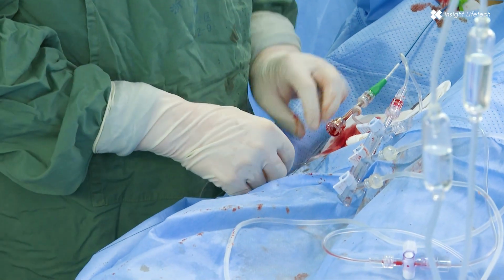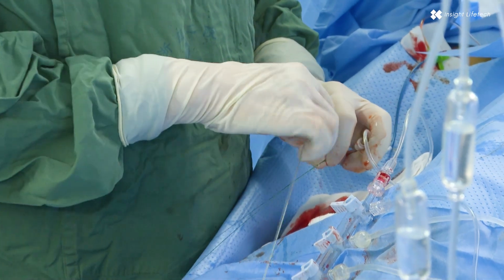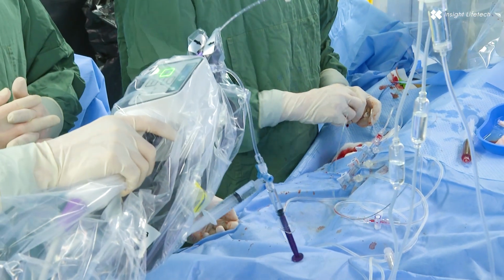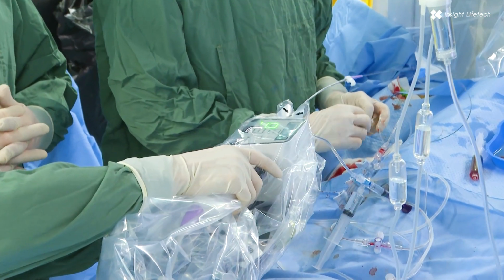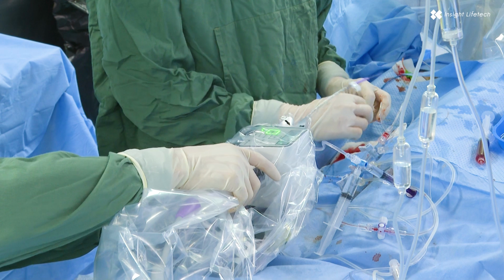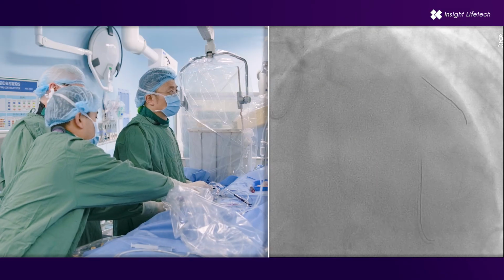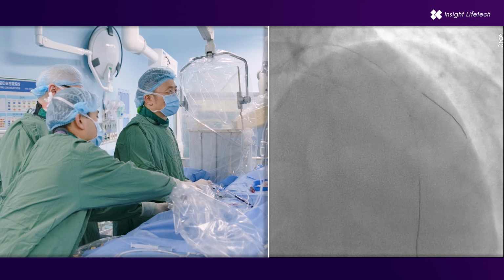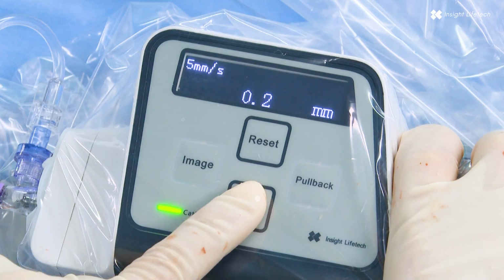However, afterwards, when we want to have very detailed analysis, we usually go for 1 millimeter per second. So our first round we will use 10, right? Yeah, usually 10 because it is tight stenosis and we can expect some ischemia during the evaluation. So, yeah.